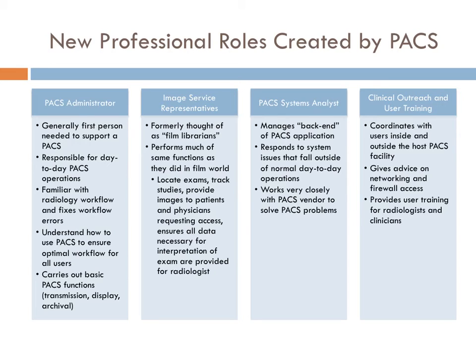Then there is the PACS system analyst. These types of people manage the back end of the PACS application, so they respond to system issues that fall outside of normal day-to-day operations. So anything that the PACS administrator does not take care of, the PACS system analyst should. They work very closely with the PACS vendor to solve PACS problems. So they're commonly thought of as the more techie person in a professional role created by PACS.